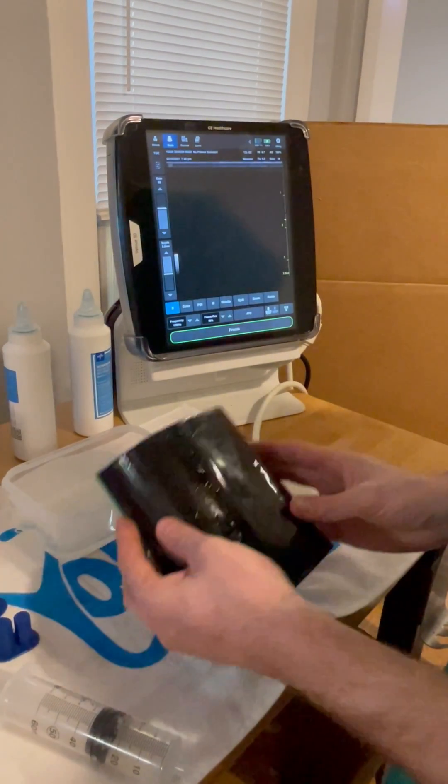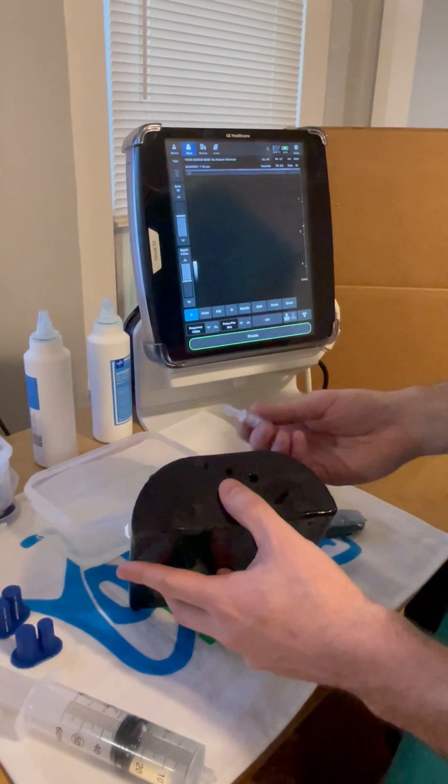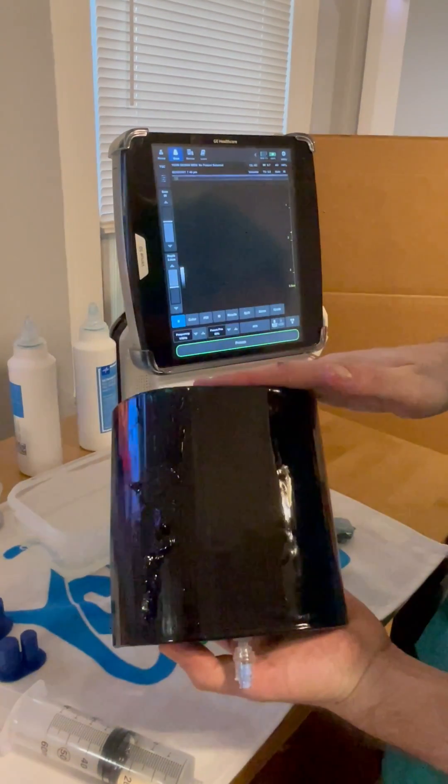When you're done with the Phantom and you want to drain out the fluid, simply pour it into a container of your choosing. The IV fittings are loaded just like a standard IV trainer, which is with a needleless syringe port, injecting water until it fills and capping from the other side.